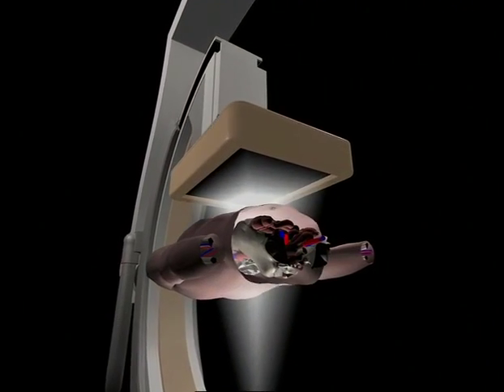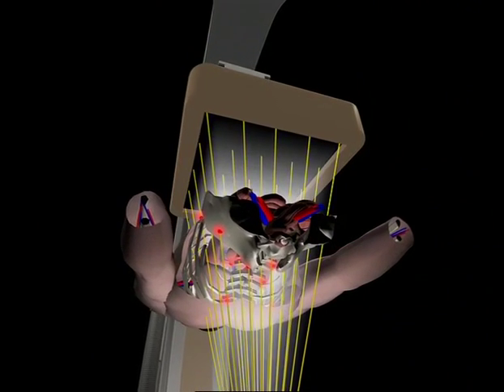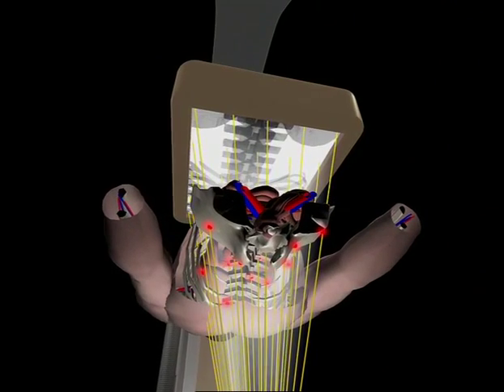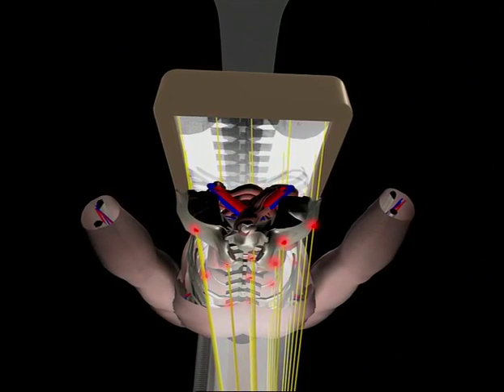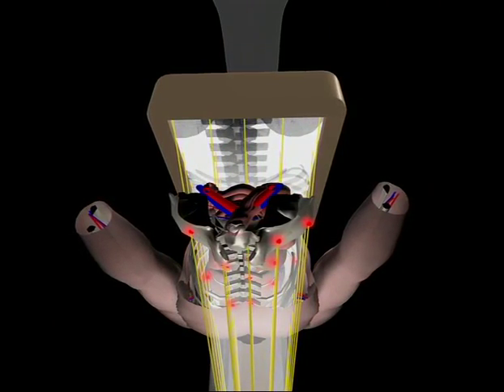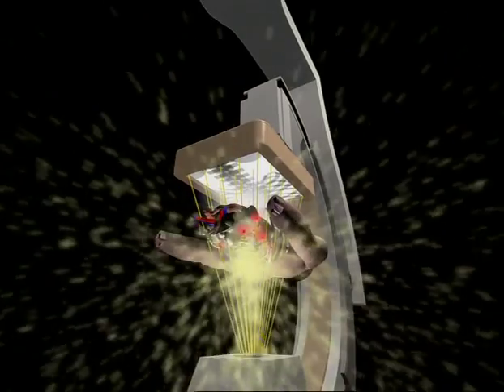The rate at which X-rays penetrate human tissue and produce the X-ray images is dependent on the X-ray type and quality. Useful beam is the term that describes this concept. Part of the X-ray beam is deflected in the tissue and randomly scattered in all directions. This is known as scattered radiation and is one of the causes of radiation exposure in attending medical personnel. To minimize such radiation exposure, it's vital that the personnel observe the safety measures shown here.